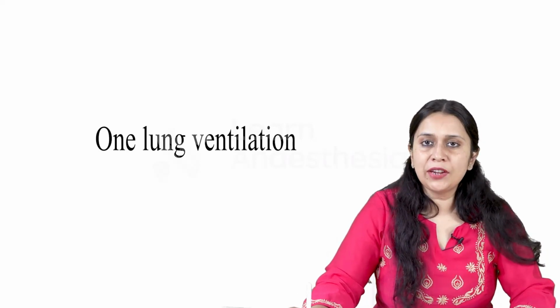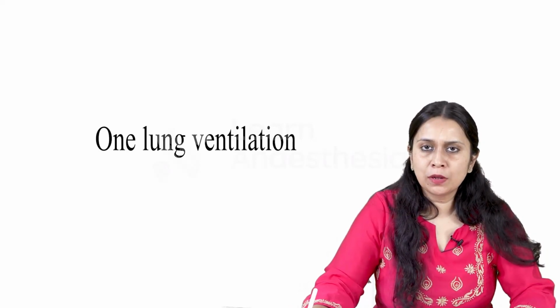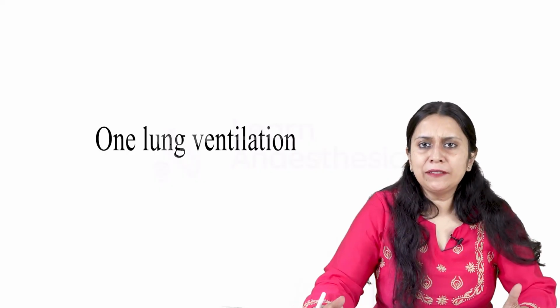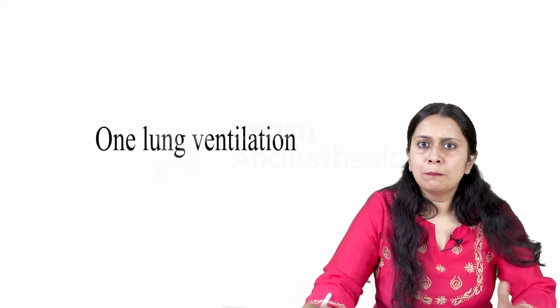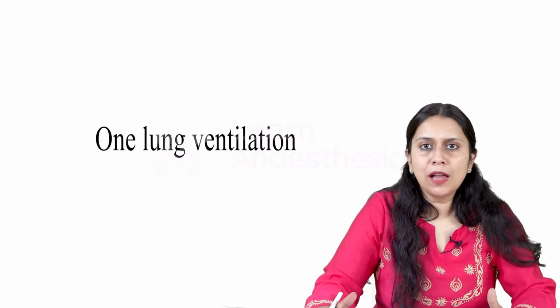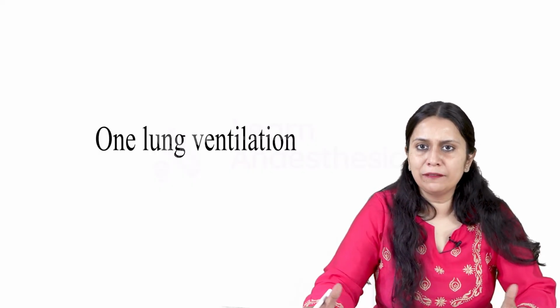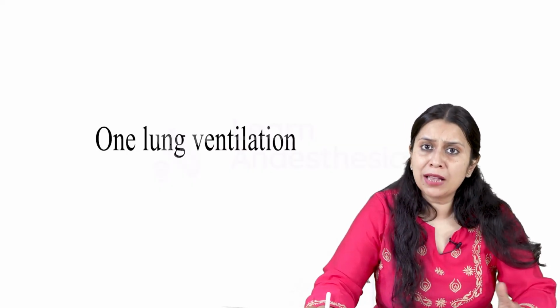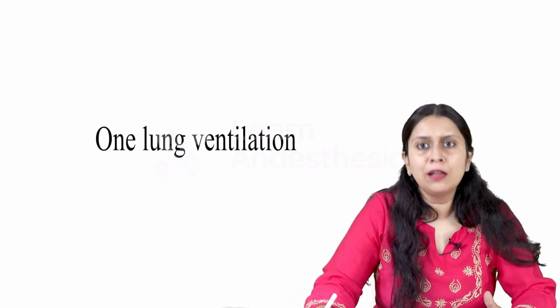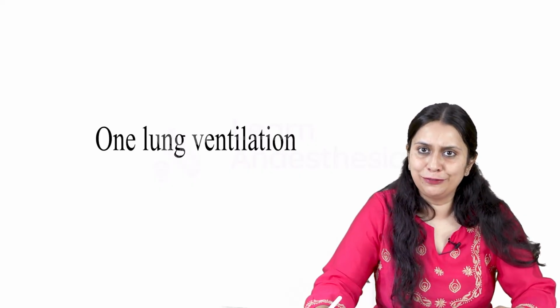So I will talk in this section about one lung ventilation. Routinely, during mechanical ventilation, both the lungs are inflated and deflated together. But when we mechanically separate one lung from another, we can practice one lung ventilation. And this is a standard procedure done during thoracic surgery to improve the visualization of the surgical field.